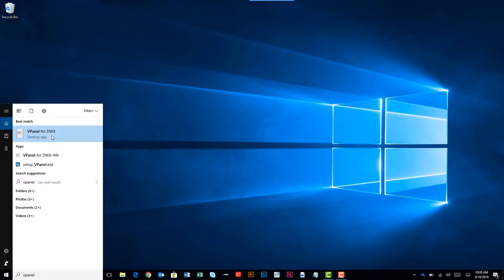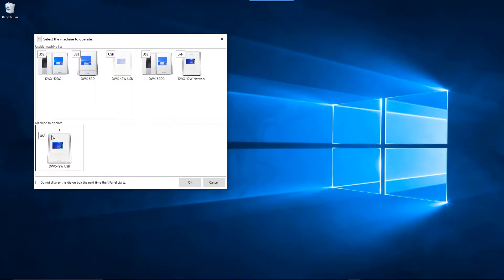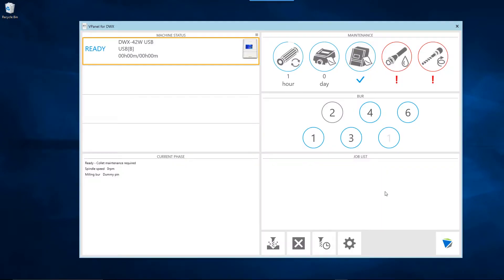Open vPanel on your computer. When the machine selection screen appears, select the DWX-42W and click the OK button. Once the vPanel home screen appears, click on the collet maintenance button.